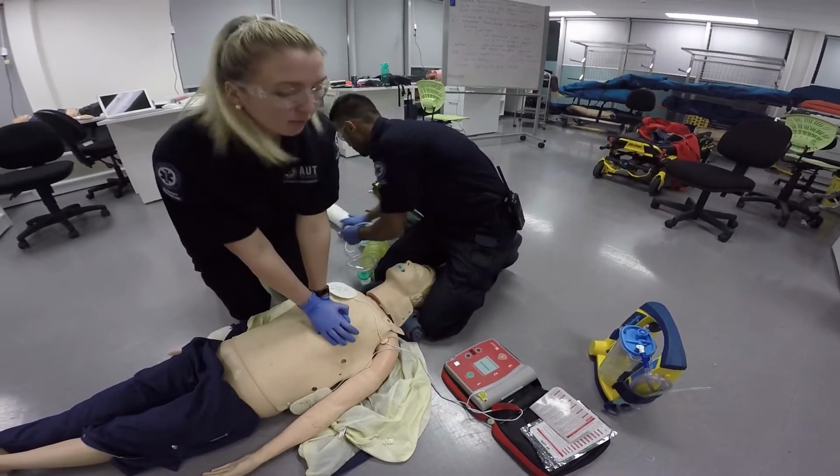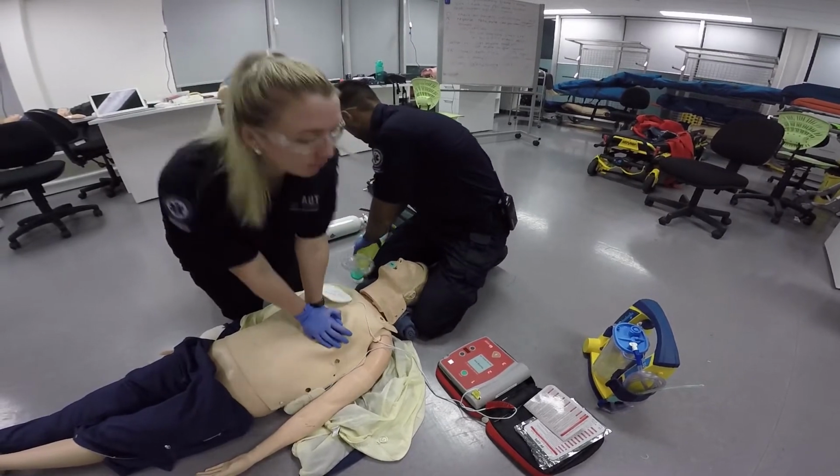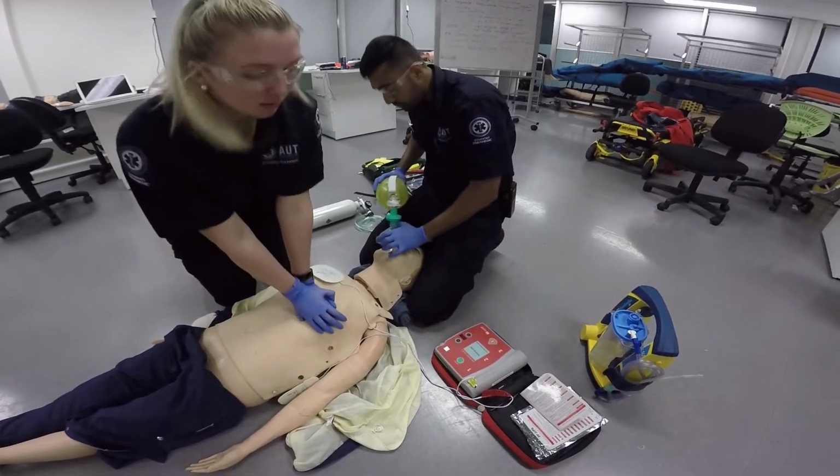Right. Anyone here know the patient? No. Alright, that's all good. And we're going to use it at a flow rate of 15 liters a minute. Alright, Shawnee, if you can just tell me when you hit 25 compressions onwards, so I can ventilate the patient.